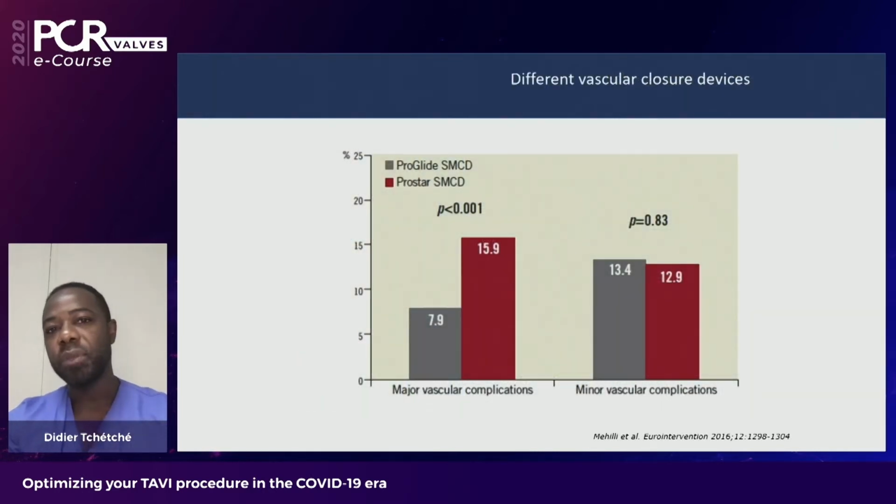So after we get the access, we have the opportunity of using various closure devices. There may be subtle differences between these closure devices, whether they be suture-based or from other technology. There have been attempts to compare these closure devices, but more roughly, you should use the one that you master and understand more about how it performs and the tips and tricks that you may use to increase its efficiency.